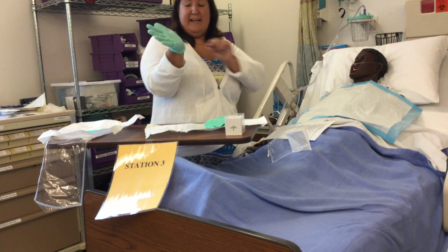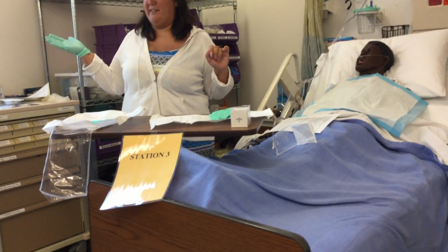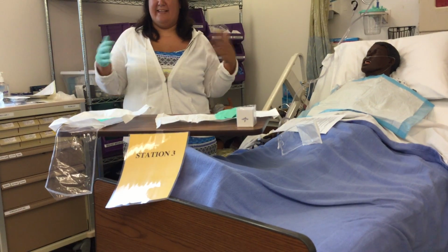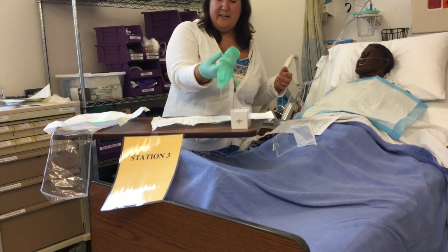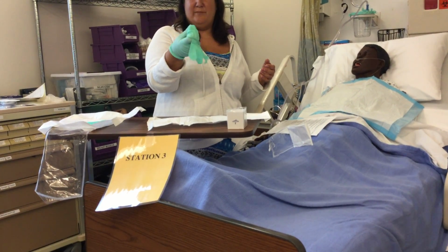So the first one you put on, you just want to make sure you hold it from the cuff, and this one really is hard to contaminate unless you try really hard. This is where you can contaminate, because you're putting a sterile hand and you're trying to get the other glove on. This is usually where the errors happen. So what you want to do is grab this just by here. You want to protect your fingers, and what are you going to do with this thumb? Thumbs up, because people want to put it here.